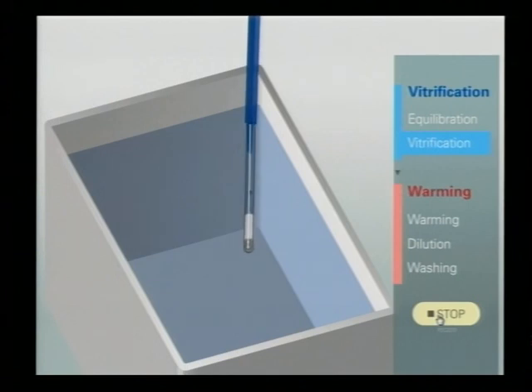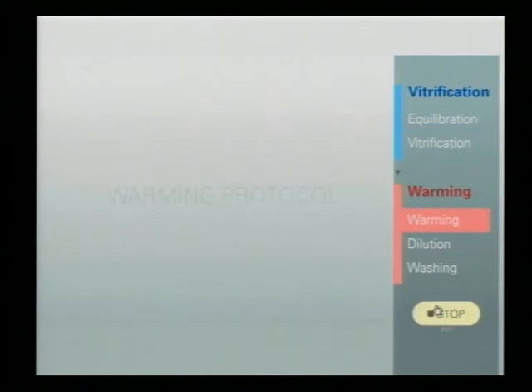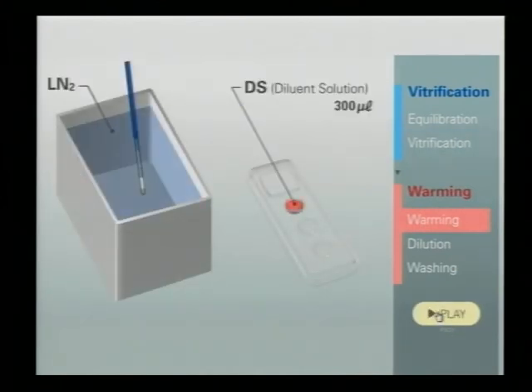This is vitrification. Okay, so for warming, it takes 10 minutes for it. The first is the preparation. So this is warming plate. Warming plate and the warming solution, just TS on the label, is stored in incubator at least three hours before the use. Because we use only warming solution at 37 degrees centigrade.